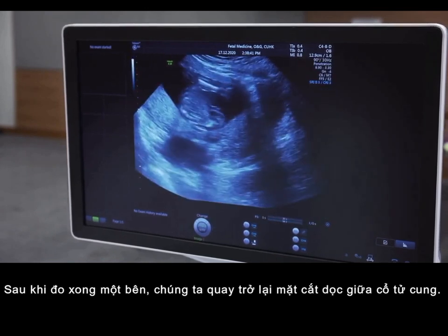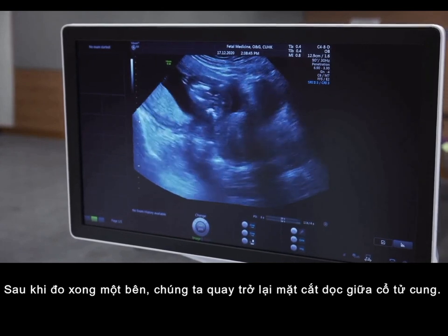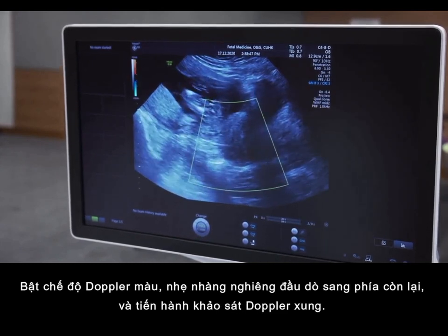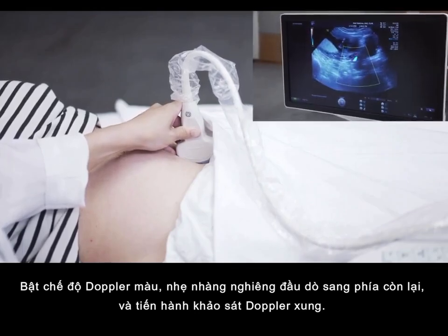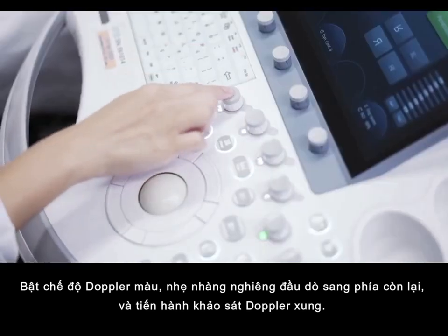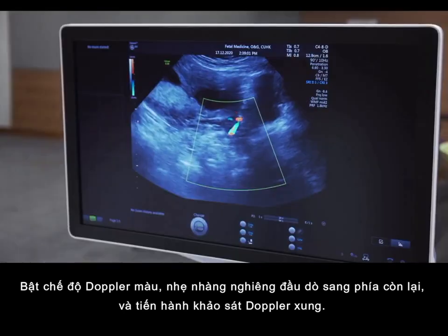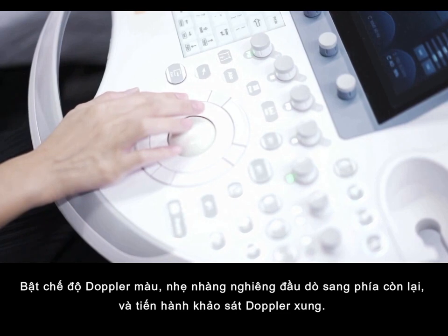Once you have measured one side, you can go back to the midline of the cervix, turn on color flow mapping, then you gently tilt the probe, and again you can use pulse wave Doppler and press the left button.